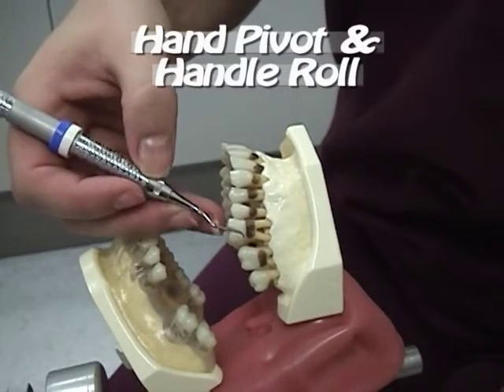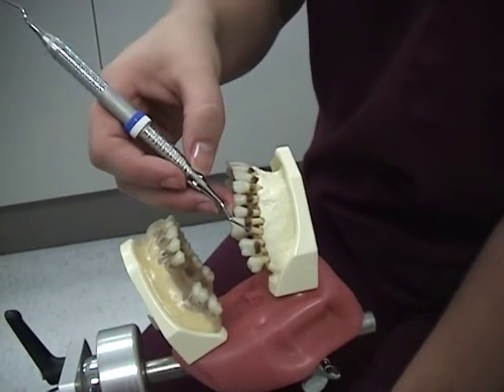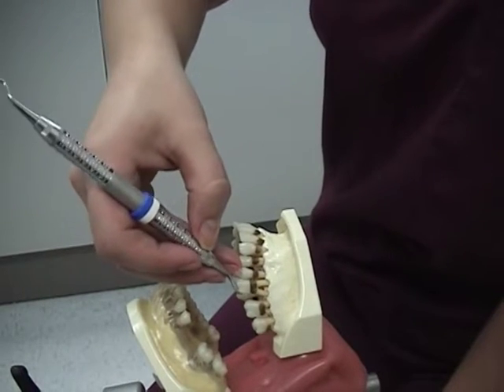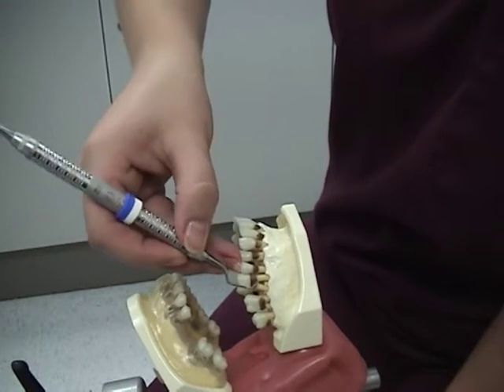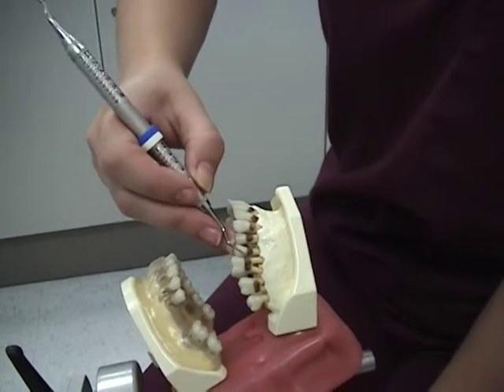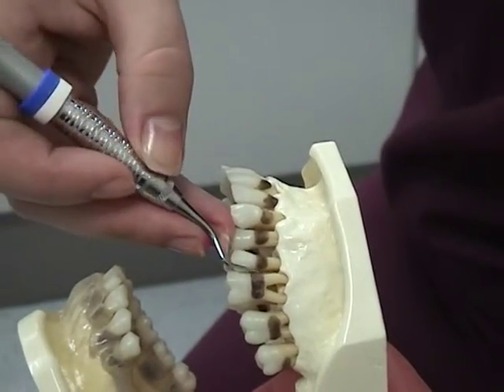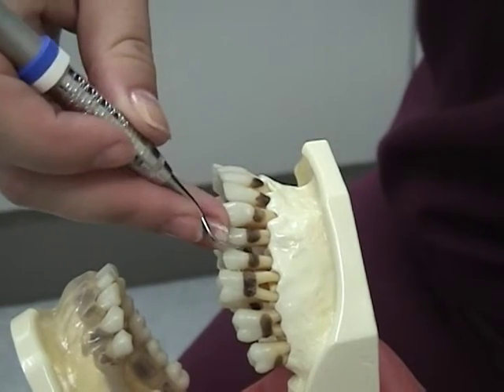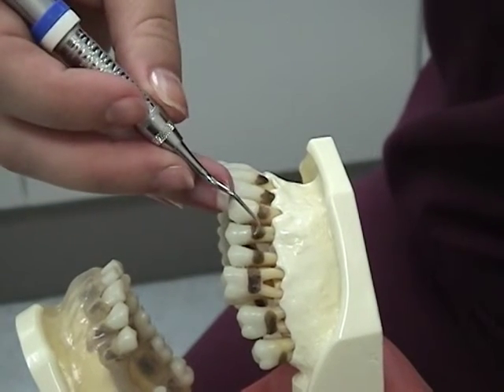Pivot and handle roll: you will need to pivot the hand and arm to maintain adaptation as the working end moves around the tooth contours, maintaining a neutral wrist position as you pivot. The handle roll is the act of turning the instrument handle slightly between the thumb and index finger to readapt the working end to the tooth. Watch the clinician pivot on her fulcrum finger as she moves around the line angle into the proximal area, and watch how she moves the handle between the index finger and thumb to maintain working angulation. Notice how the instrument — not her arm — turns between her fingers.